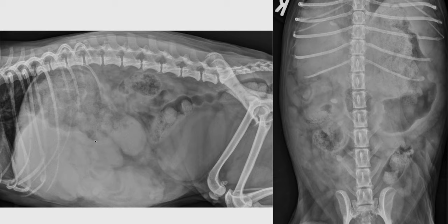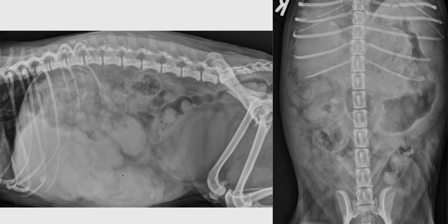Here we would think more of a hepatic mass rather than a diffuse hepatomegaly because we do not see really well the margins of the liver. When we think of hepatomegaly secondary to a steroid hepatopathy, for example, we usually delineate really well the margins of the liver, which is not the case here. So a mass coming from the liver is the most likely differential diagnosis for this mass lesion.